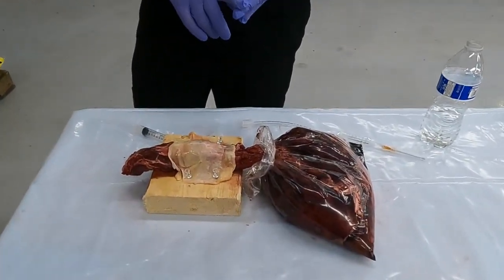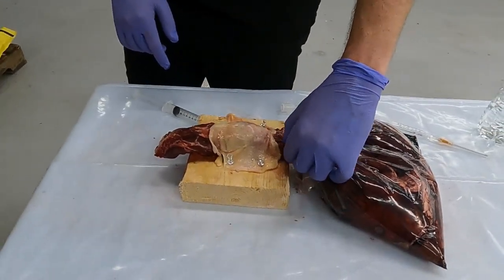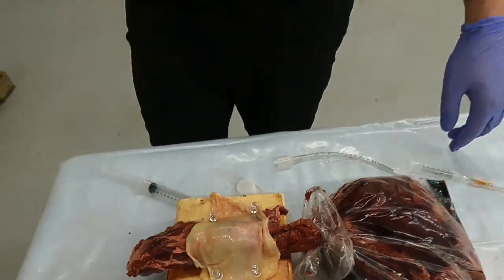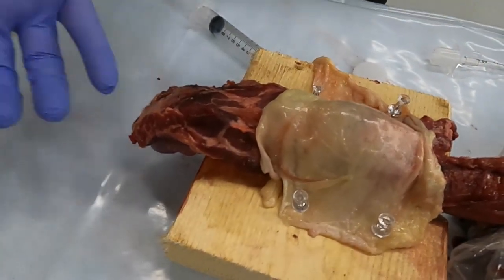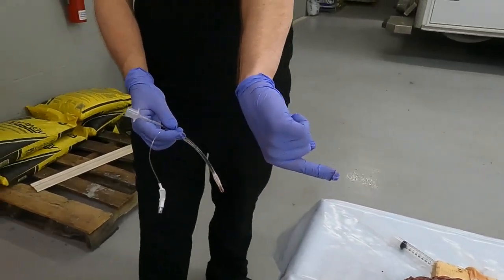This is our pig pluck lab. We're working with a pig pluck that goes from tongue to diaphragm; inside the bag are the lungs and the heart. Sometimes we have issues with the trachea because of how they're processed — right here there's a rip in the trachea, so it won't seal well. We'll intentionally show what it looks like to do a right mainstem, then back it out, though with this tear we may not be able to inflate the lungs well. We're not going to use a blade because there's no mouth to manipulate.